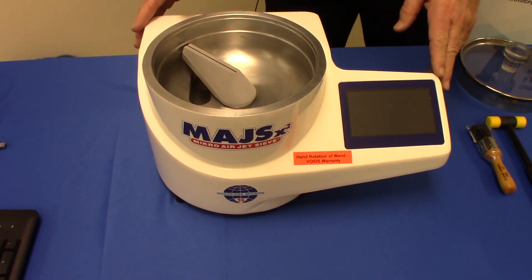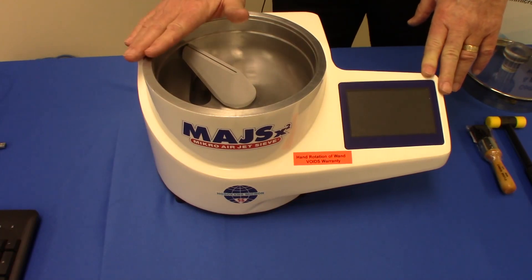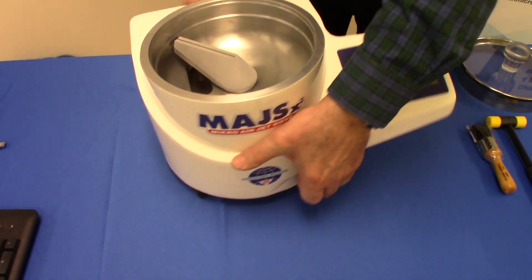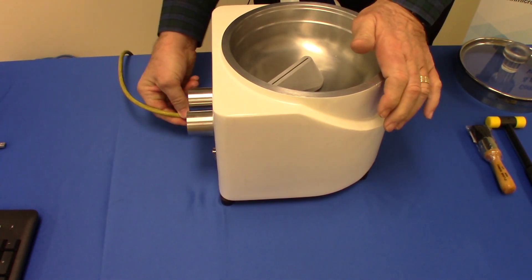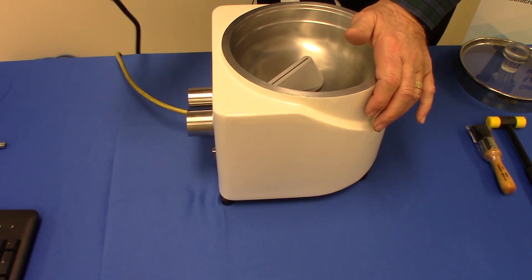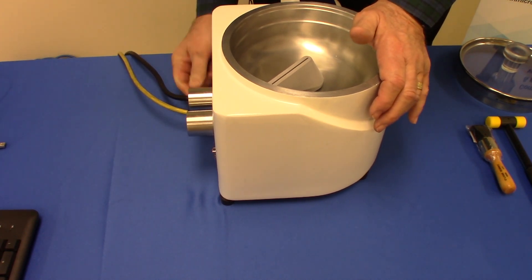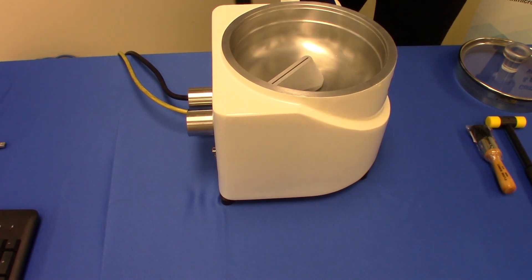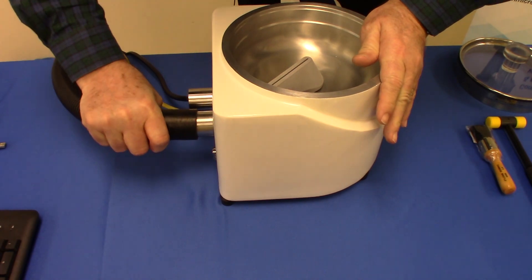Today we're going to talk about the setup of the Micro Air Jet Sieve model X2 basic mode of operation. The basic mode of operation is very simplified as far as the setup. We must make certain that our vacuum power supply is attached, and most importantly, the power to the unit is attached to the back.